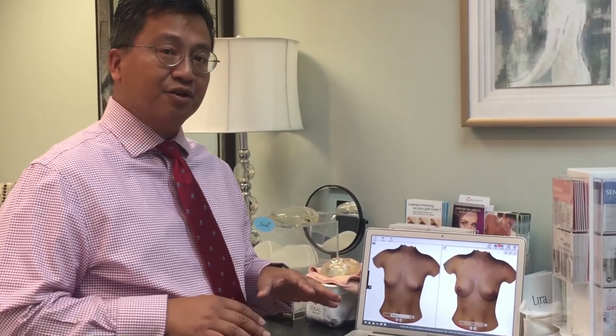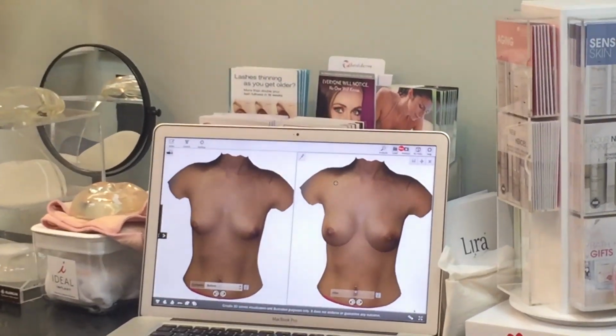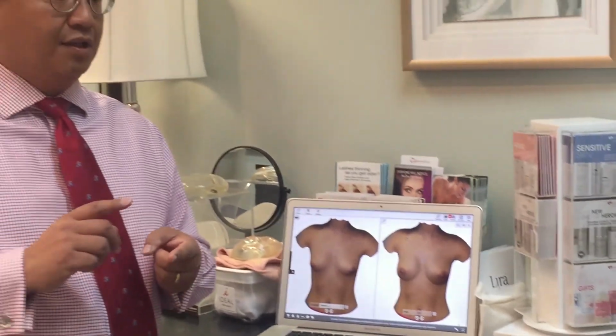So one of the concerns that she had, which a lot of people have too, is what am I going to look like after surgery? How can I really envision what that's going to be? And a lot of anxiety is there, and this software really helps allay those fears, make you feel comfortable about your choice, and then go into it with not a lot of uncertainty. So after we've had a long discussion about any medical history that my patient has or surgery history, medications and allergies, then we go into a lot of the fun stuff, which is basically, what cc's of implant will really look great on my body.